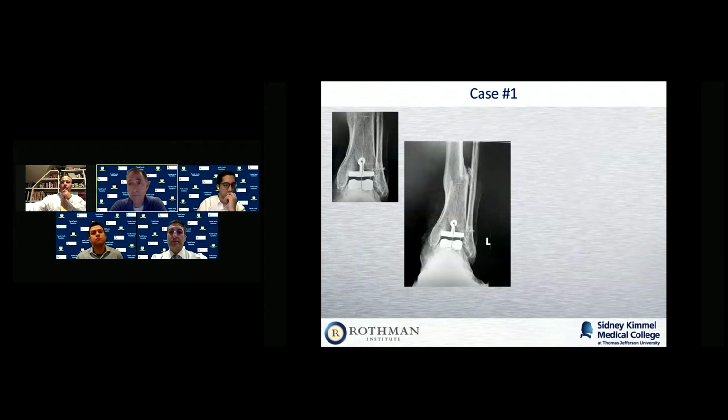The injection helps. Well, it tells me that she's developing some medial gutter arthritis, and if this is left alone, likely a high risk of early failure. So things should be addressed surgically. So Justin, what are your thoughts about what the options are here? Yeah, I mean, I agree. It looks like it mainly involves the gutter. I mean, I'd like to see it. What was the failure here?